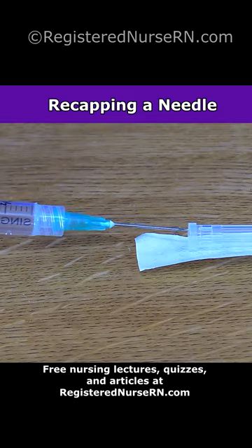I want to demonstrate how to recap a needle using the one-hand scoop technique. You want to avoid recapping needles due to the high risk of needle stick injuries.